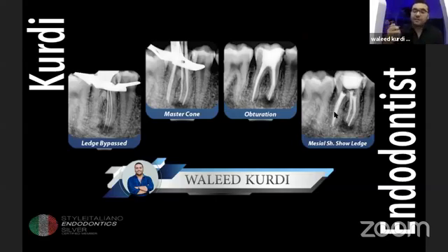I put it without activation in an offline mode, then I activate when the flutes of the file are engaged inside the canal. And here in the two mesial canals, I shape up to 30/04. And here is the obturation you can see. Here is the obturation with the mesial shift.